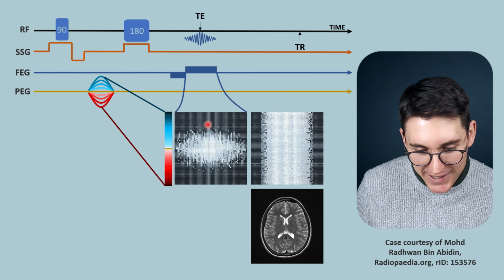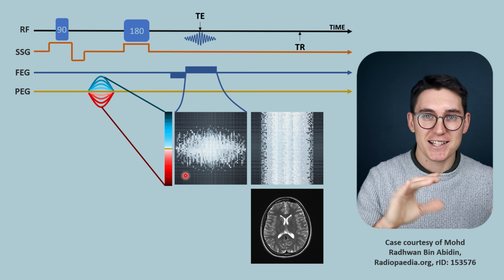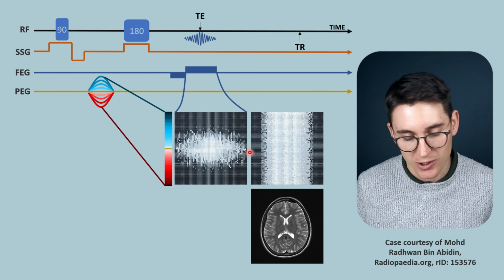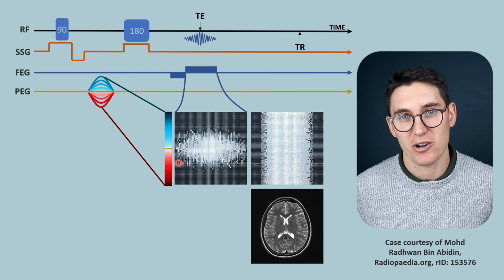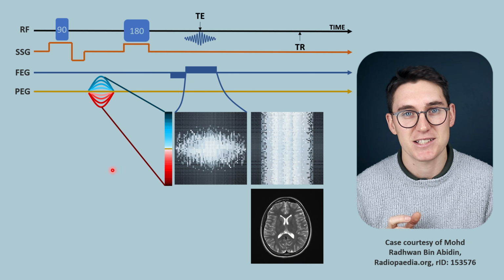We know that any individual point in k-space represents the net magnetization vector of the entire slice at a given period of time. But one data point is not enough to create this image here. We need all of these data points in combination to create the MRI image. Now I know that this phase encoding step is very difficult conceptually to understand.